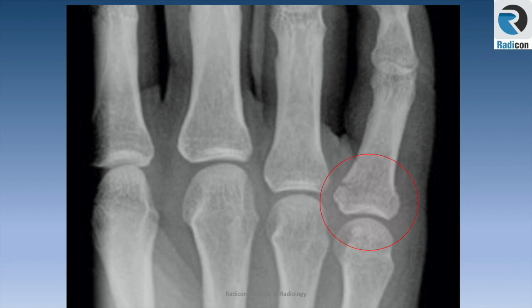In many countries it is normal to call it a 5th proximal phalanx fracture, which is acceptable. However, UK radiologists are generally not familiar with that terminology. The usual way of describing it in the UK would be: fractured base of proximal phalanx of the little finger.